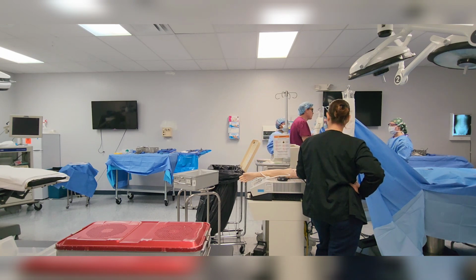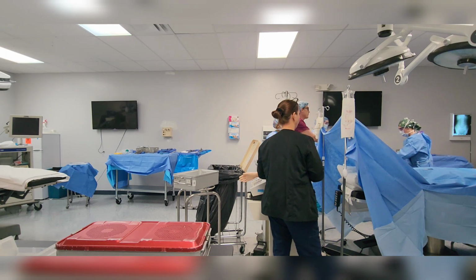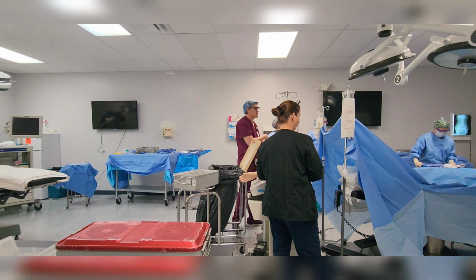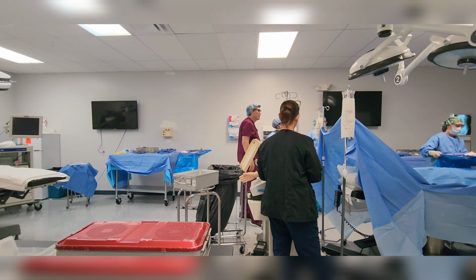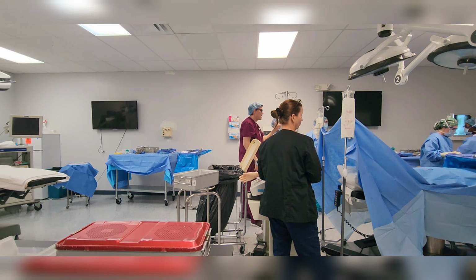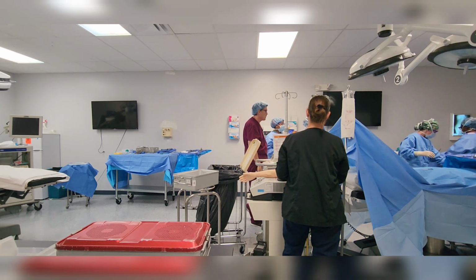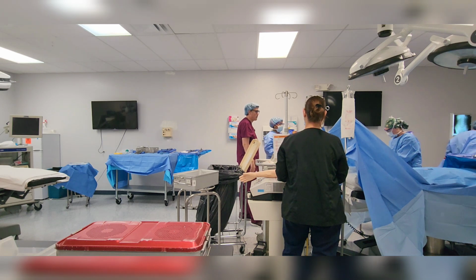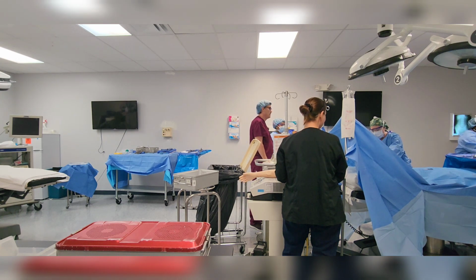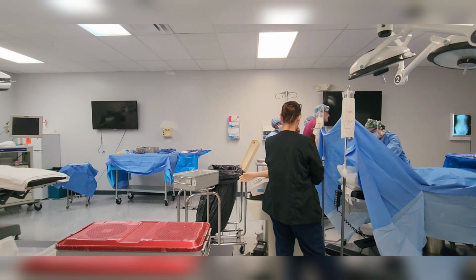So, you know, again, don't do anything out of normal, but this is a normal thing. Let's start pulling stuff up. How can you start helping? Right. Start pulling things around, start passing them off, right? There you go. You got it. So it's all a team effort. Now, I'm looking at how you're doing that. That's Jacob. There you go. Put your hands above. I'm just as guilty of putting my hands below, but I'm trying to teach you good habits. So I have a 400-pound ortho table. Last thing I want to do is do this, but I would always get yelled at. That's what we've got to teach you to do. Good job.